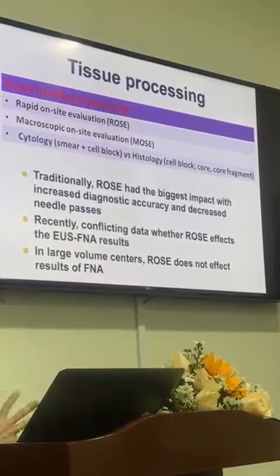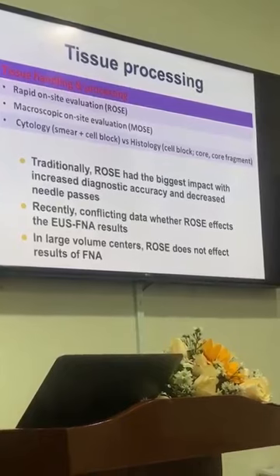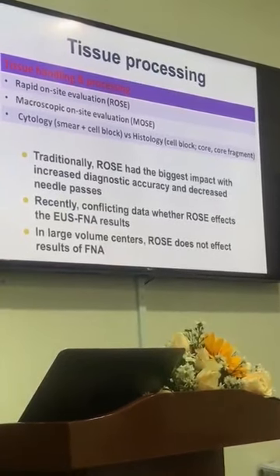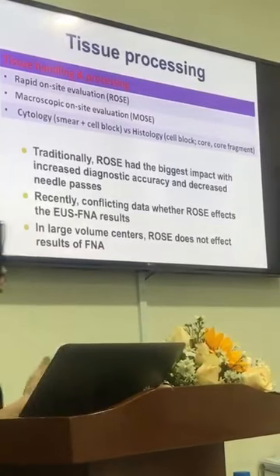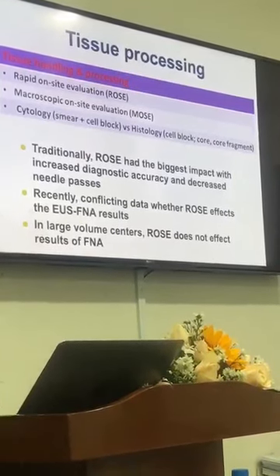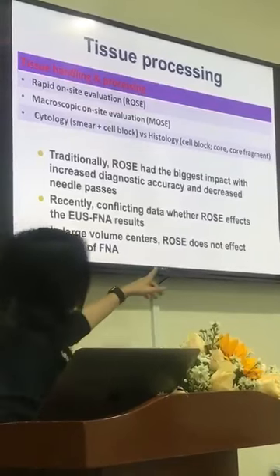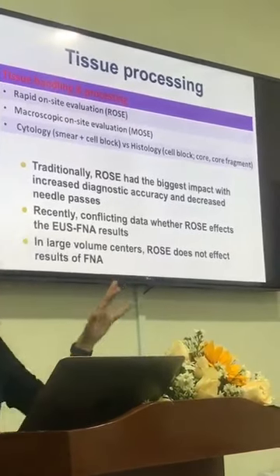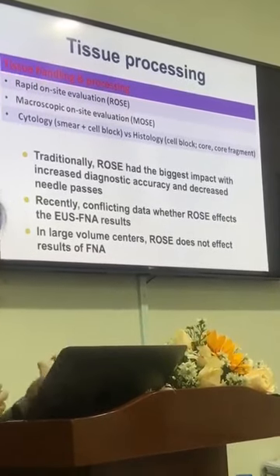But just recently, there have been some conflicting data as to whether ROSE would affect FNA results. And the reason I'm saying that is because as you do more FNA, as the study comes out more from large volume centers, we found that ROSE doesn't really affect the results of FNA. It's the sonographer's experience that really affects the yield.